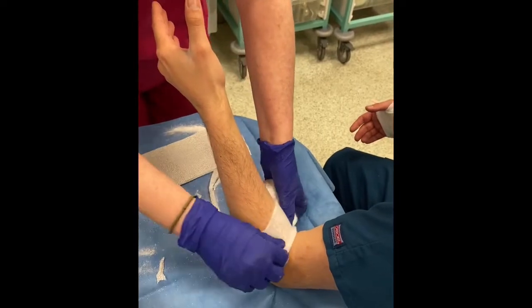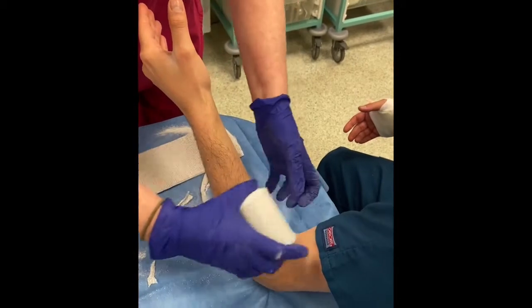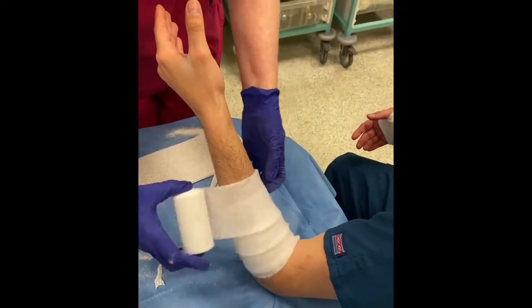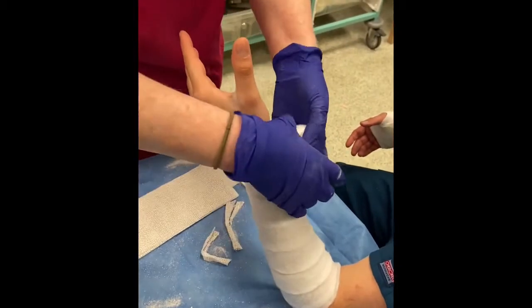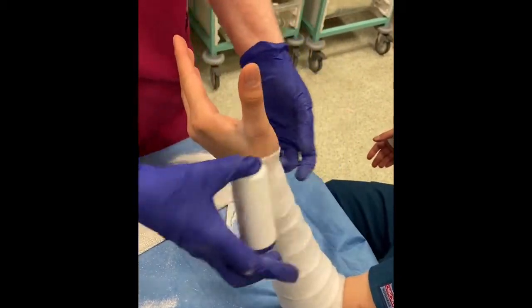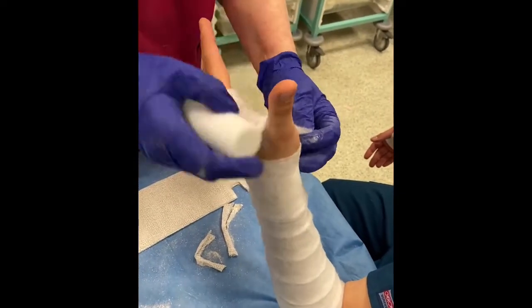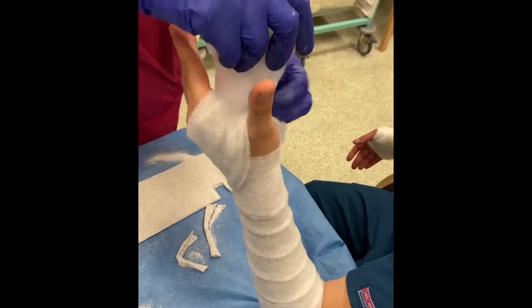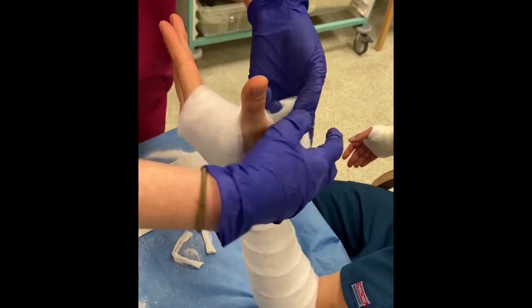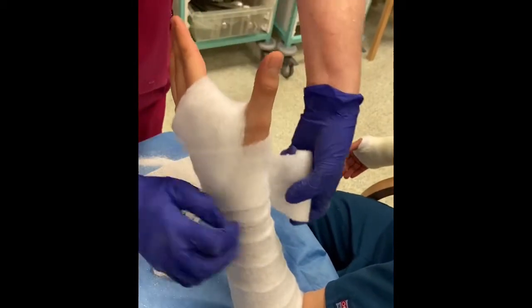Padding is then applied to the limb. This needs to start above the end of the back slab and be rolled down over the limb, overlapping by about 50% each time. Padding needs to be applied right up over the knuckles and around the base of the thumb. There are some pressure points, particularly around the radial styloid and the ulnar styloid, which need to be particularly well padded.